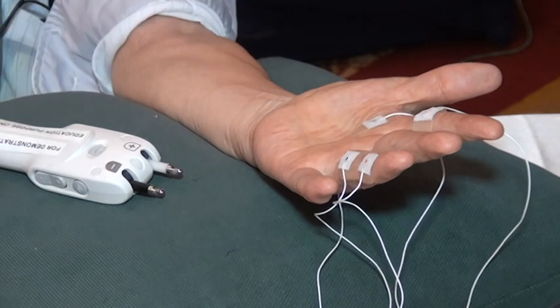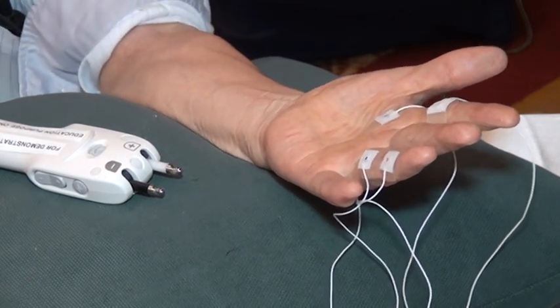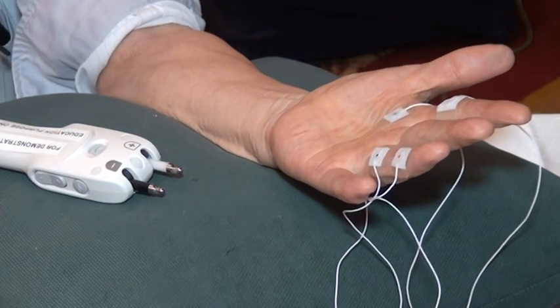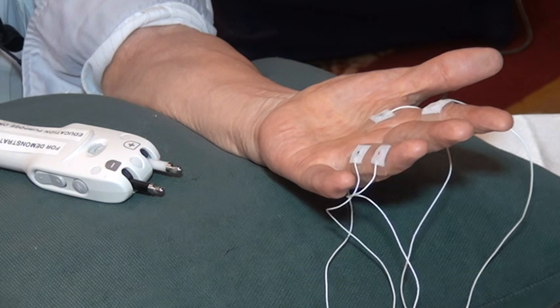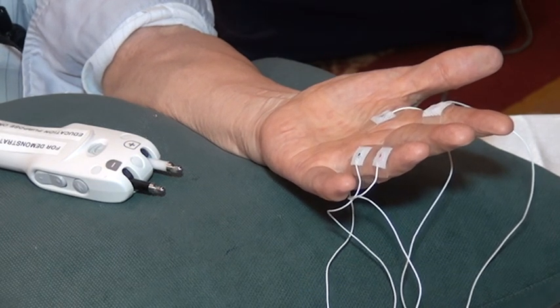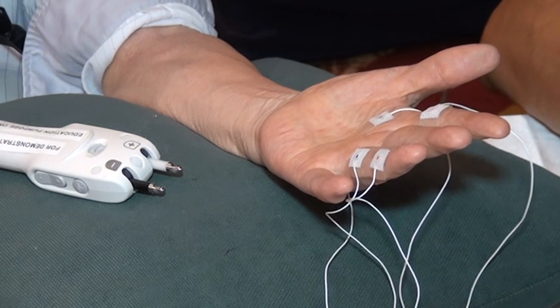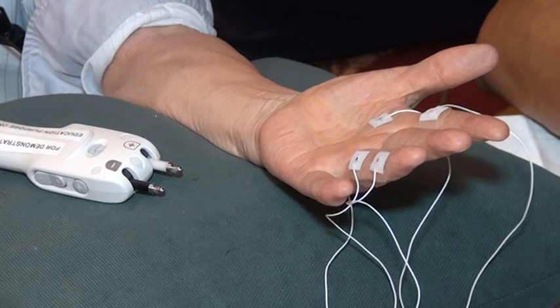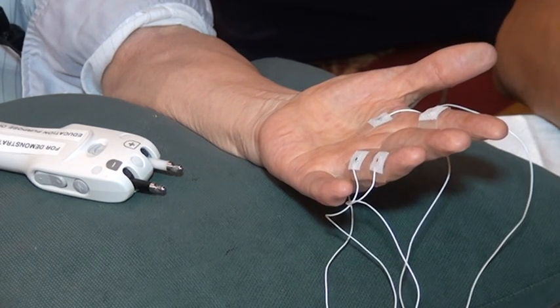And you see at the bottom, the first one is not a very good response because the stimulus artifact is not controlled. The rest is pretty good, and this marker should be moved here. Can you move it? No. I will move it. Yeah. You see where the takeoff is? Takeoff is a little difficult to see, and this one is probably around here.